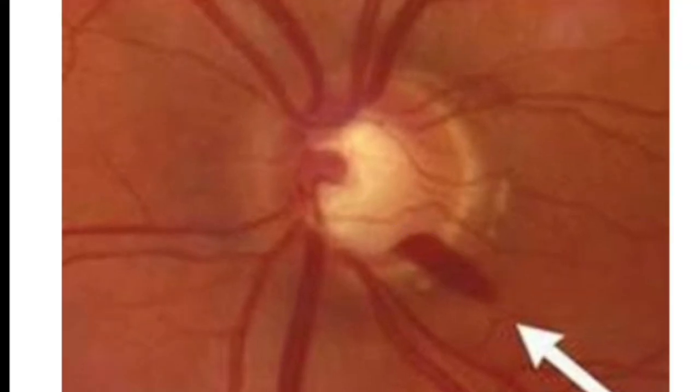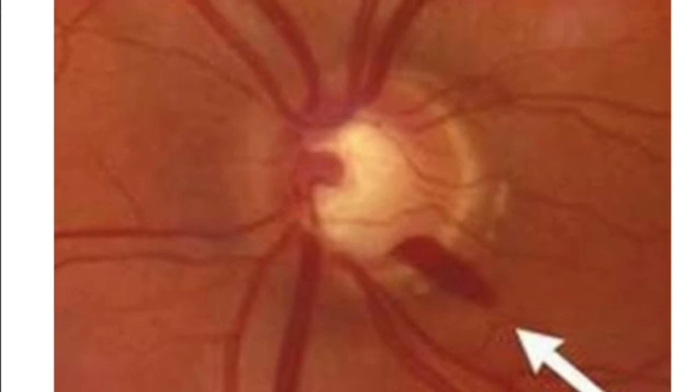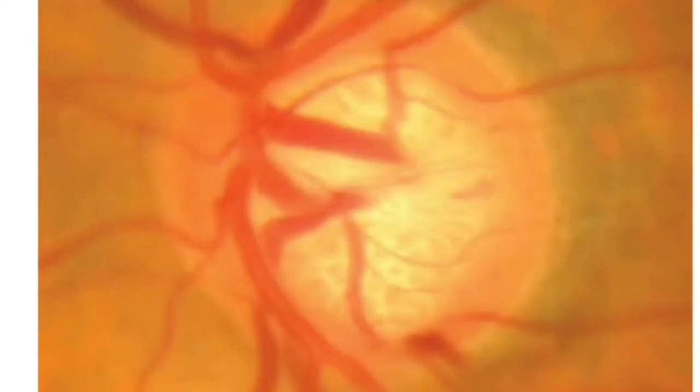It is more commonly seen in normotensive glaucoma patients and glaucoma patients who have associated diabetes mellitus. It is seen in early to mid stages of glaucoma damage, and it usually decreases when the glaucoma advances. Though not pathognomonic of glaucoma, it is a significant finding as it appears even before there is an RNFL defect or the notch. So that is the significance of optic disc hemorrhage. This is one more picture where you can appreciate optic disc hemorrhage in the inferotemporal quadrant.